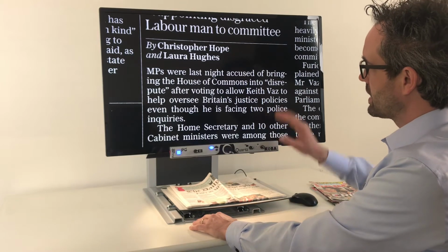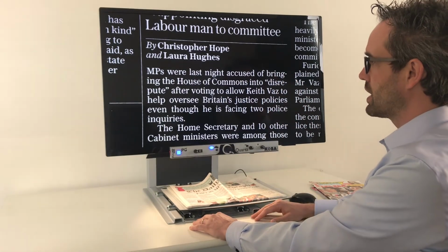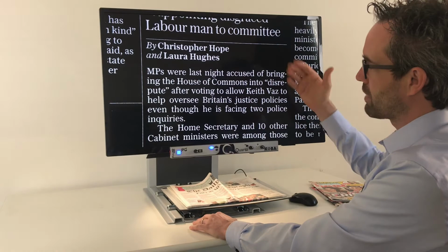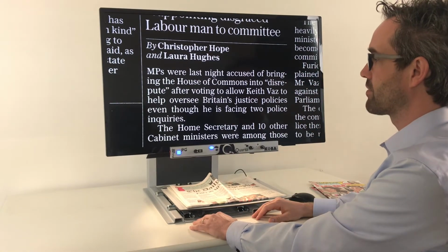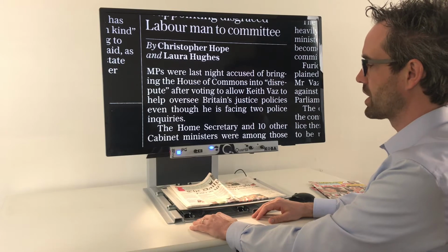Most people read in high contrast modes, and most of the time it's with a black background and white letters, because in this case there's less light from the magnifier.